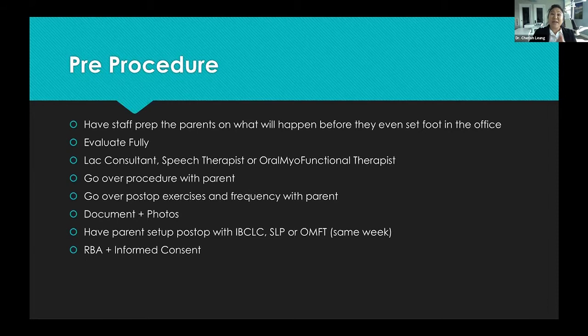I ask them if they're able to please pump 1 or 2 cc's, so just a little tiny amount of breast milk, and bring it. And what we do is we take a sterile syringe, we fill it up with that breast milk, we put it in the freezer while we do the consultation. And then afterward, I just squirt that breast milk right on the wound, healing properties, comforting, all of the good stuff. If there's any liquid gold left, I put it right back in that bottle because it was a sterile syringe, totally fine. And then for the parent to take home.